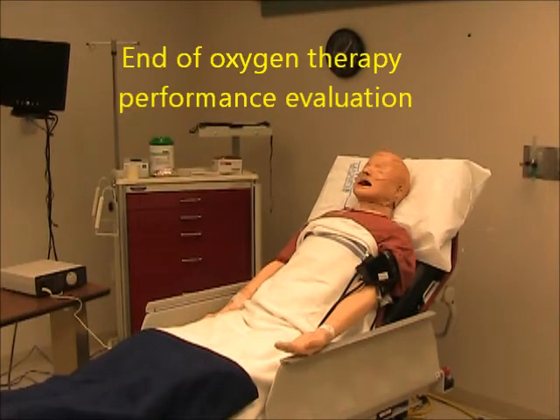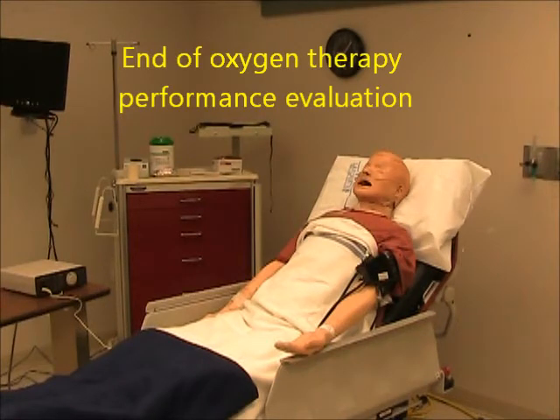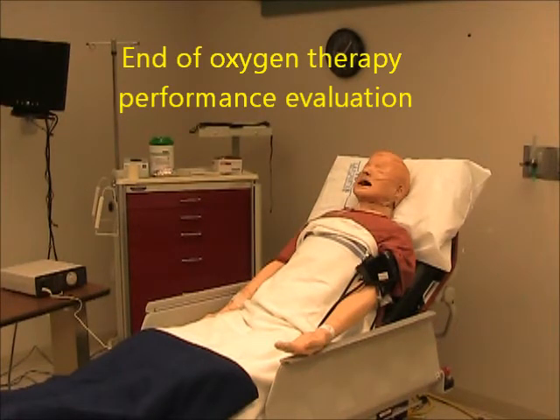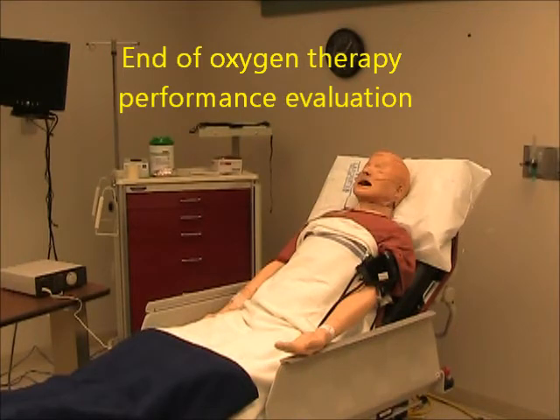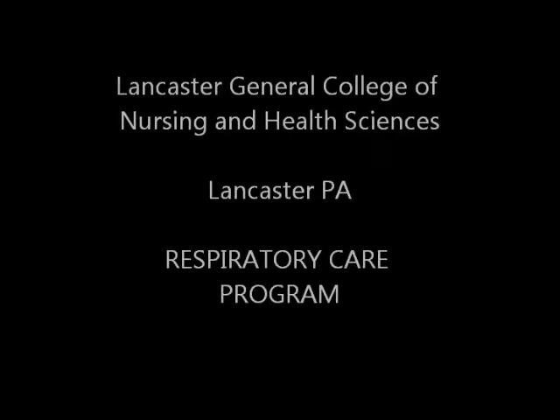This concludes the Oxygen Therapy Checkoff, or Cannula Oxygen. Okay, thank you.